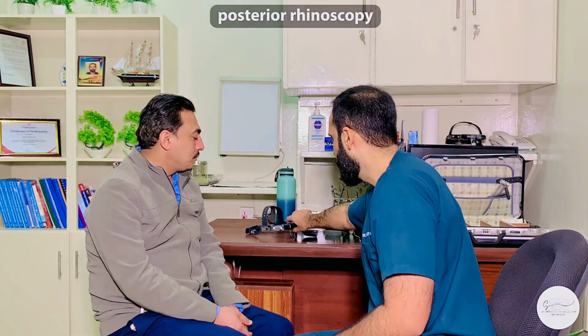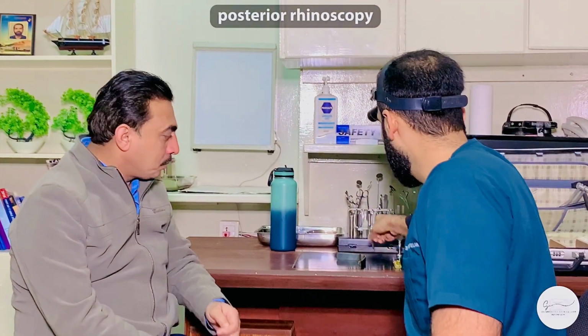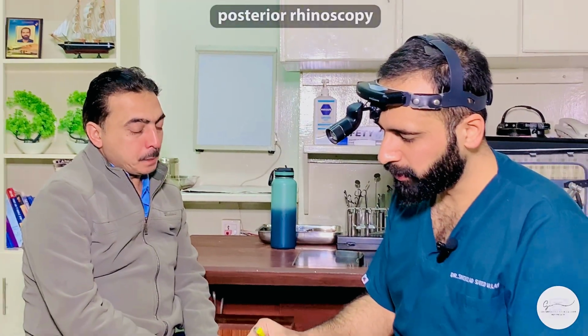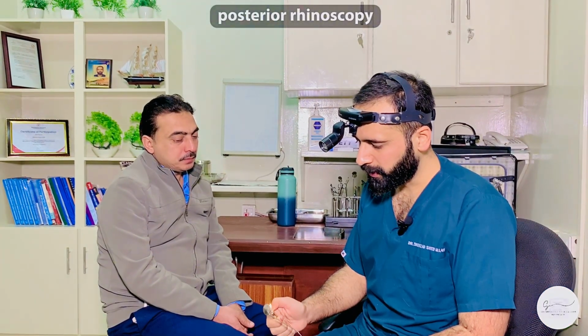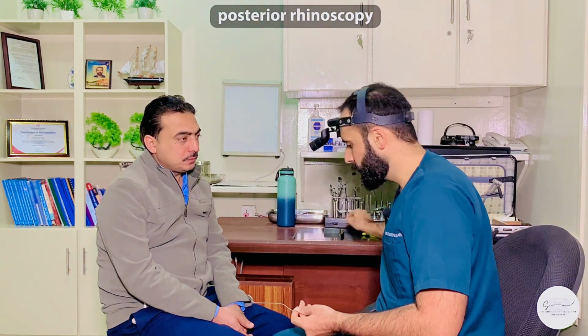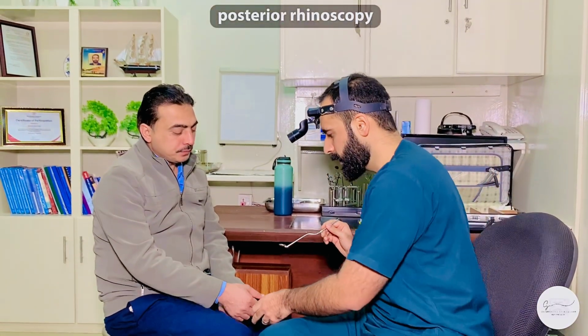So for that, you will take a headlight, you will again wear it, you will take a posterior rhinoscopy mirror and you will heat it on the mirror surface. You take a lighter, gently heat it, and then you will first test it on your own hand to see whether it's too warm, and then you let the patient sense it.